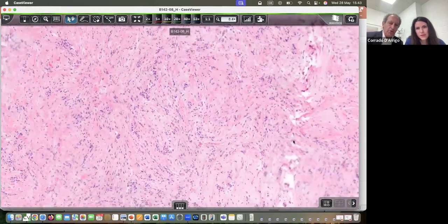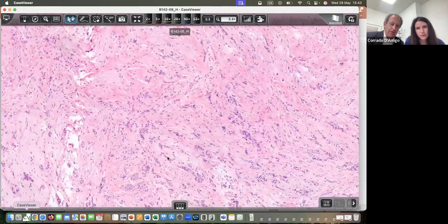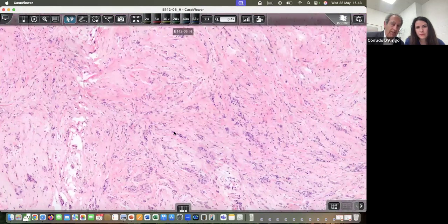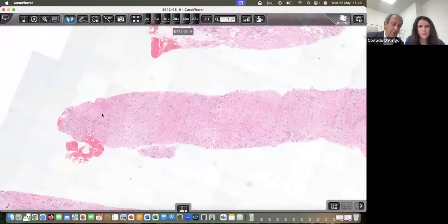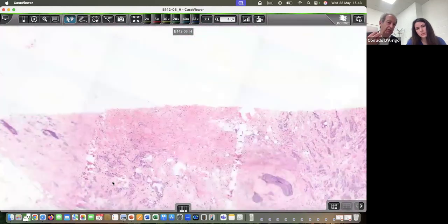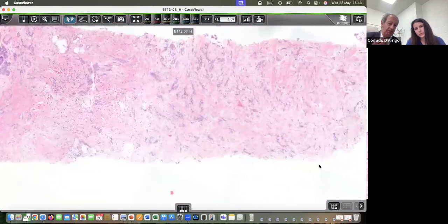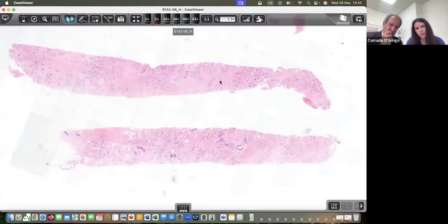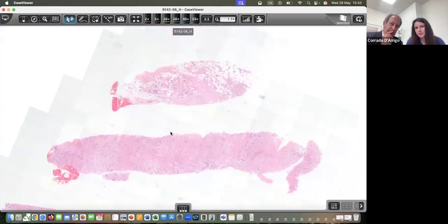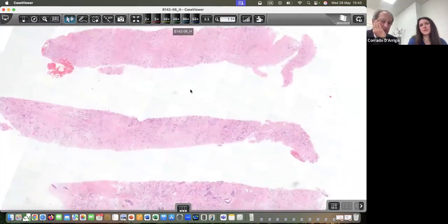Okay, so, is this a triple negative? Interestingly, look at the H&E, because the H&E will tell you what is the surface area of the tumor tissue. You remember, this needs to be tumor tissue, not necrotic tumor, not area of tissue with benign epithelium. Usually in core biopsies, if I do have a significant area that is no tumor, I tend to exclude it, because sometimes it just feels like it's the edge of the tumor.